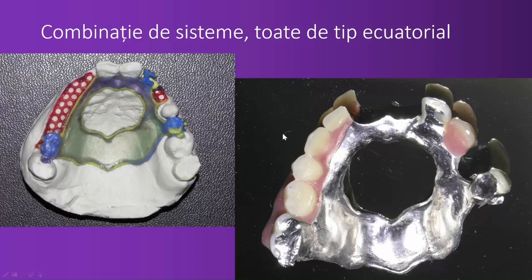This is the finalized denture, and we understand that in that molar, we have the rider that sits on the bar that is placed on the mesial of the molar. And here we have the second premolar that hides the rider that goes, again, on another bar that goes interdental. And inside of this lateral incisor, we have another click type retentive system for a ball attachment, or a sphere as it's called. So you see sphere and bar.